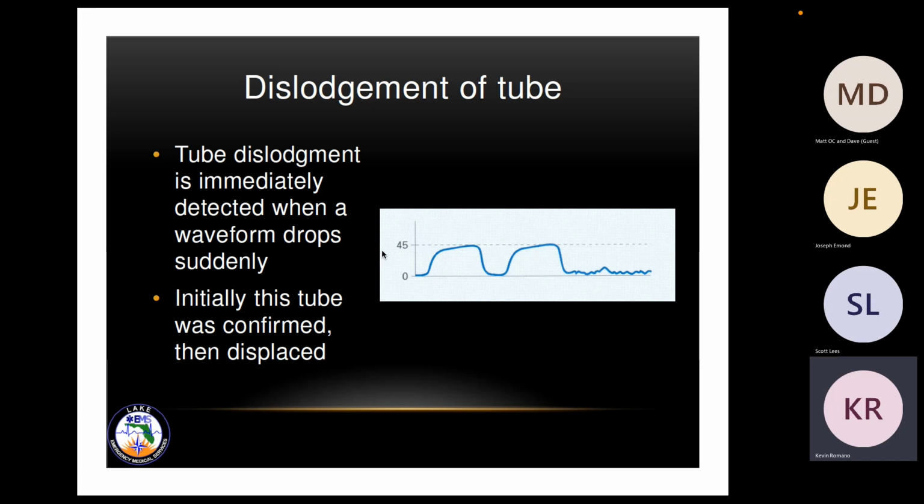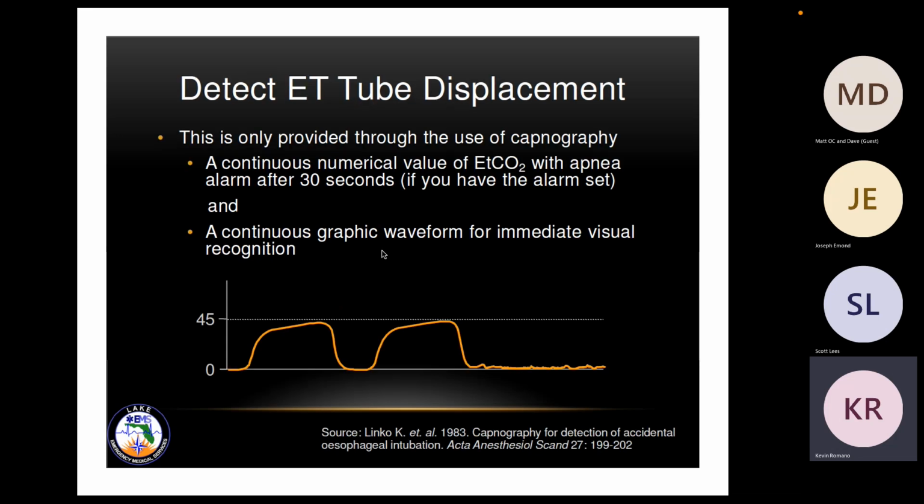Make sure there's actually pressure in there. We're not losing any kind of air. This will also change a lot in your pressure alarms as well, along with your minute volume alarms.